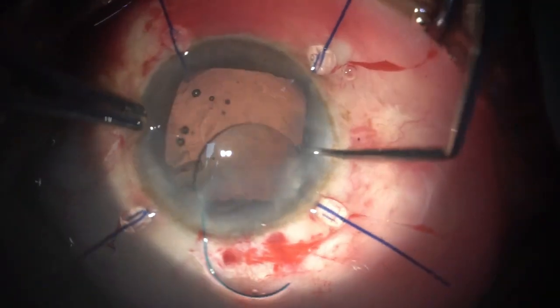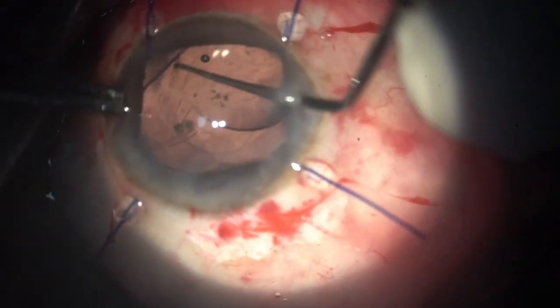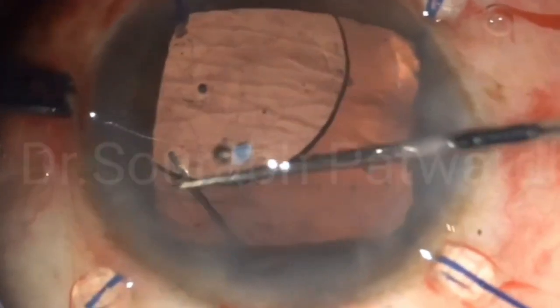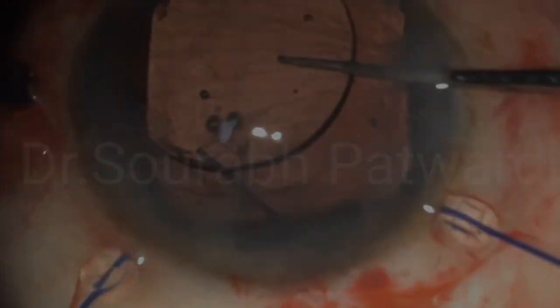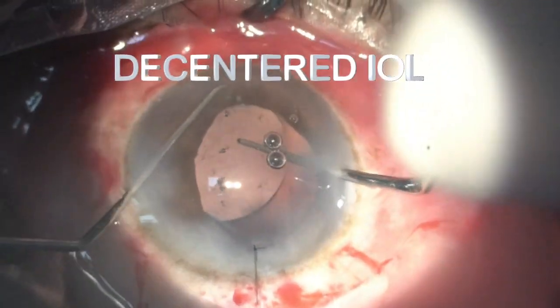Now here comes an idea. If you can't bring the leading haptic up, put the trailing haptic in the sulcus first, then use it as an anchor to bring the leading haptic into the anterior chamber. Now both the haptics are in the sulcus and the IOL is still decentered.